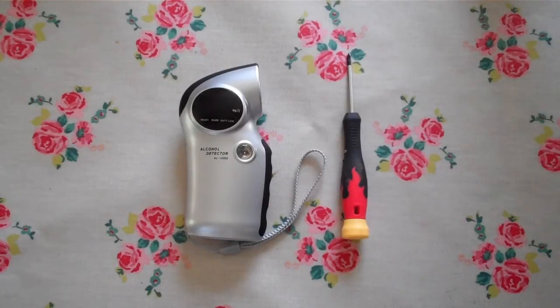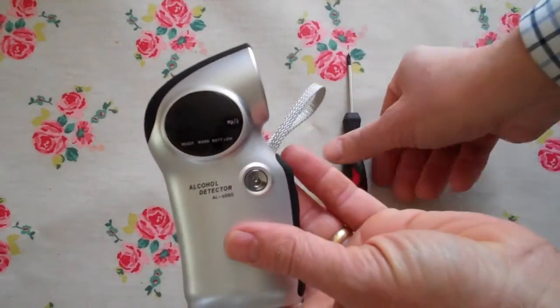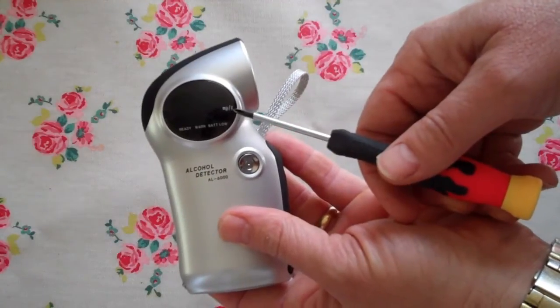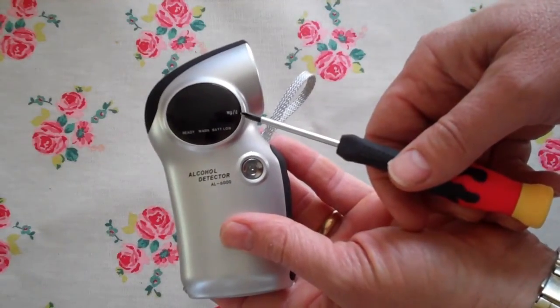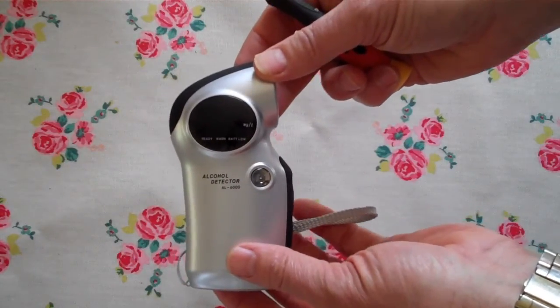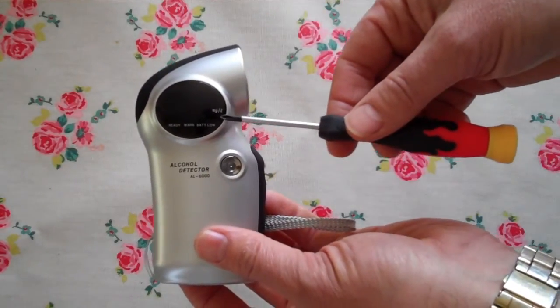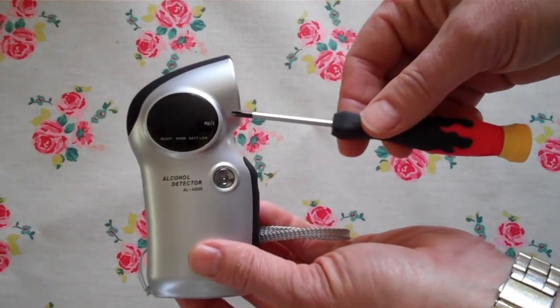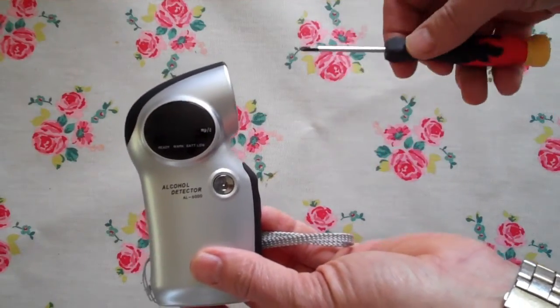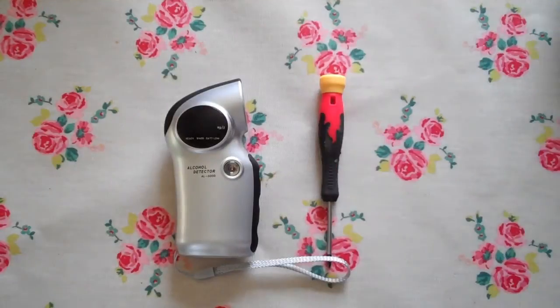An important feature is that you must match the sensor to the predetermined manufacturer's display scale. On this model, shown here on the actual display, you have milligrams per litre — that is the display scale of alcohol shown by this unit. When you buy your replacement sensor, you must ensure you are buying a milligrams per litre sensor. If the display showed a different scale, such as percentage BAC, then it's critical that the sensor you put in matches that — a percentage BAC sensor.